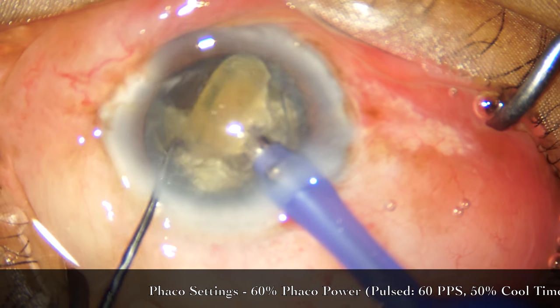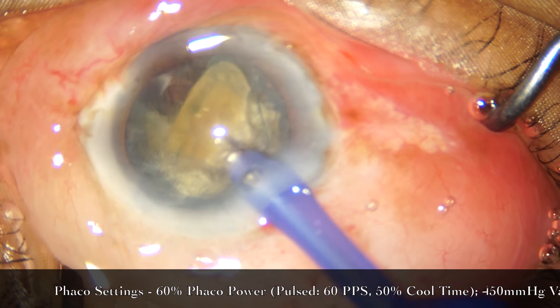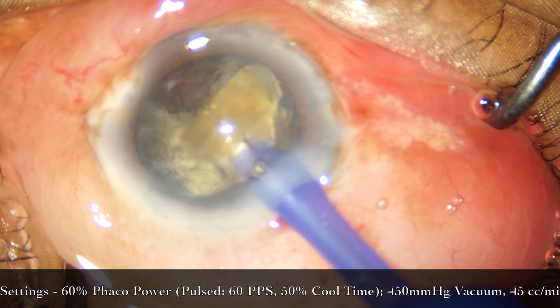We've managed to break the nucleus into several fragments and we're going ahead and emulsifying each of these fragments now.